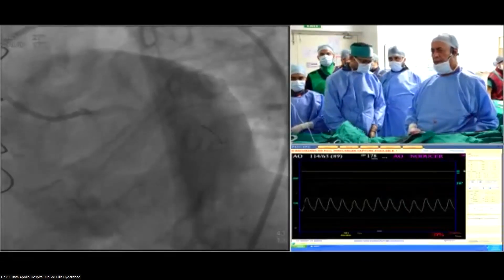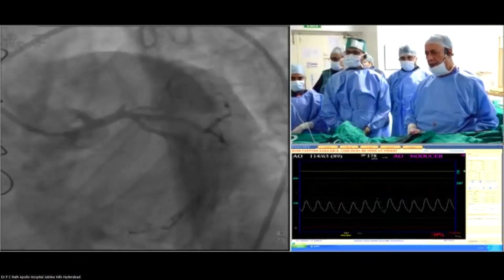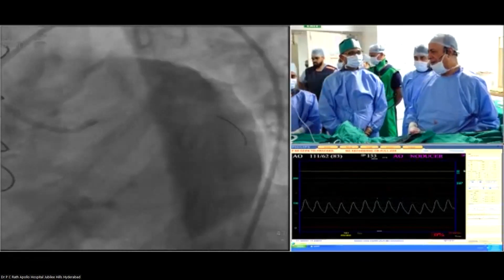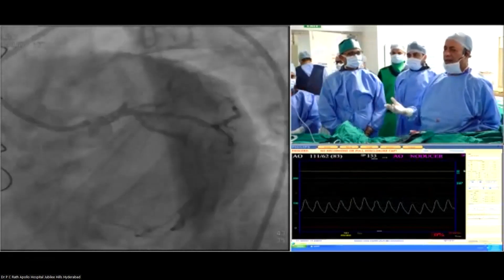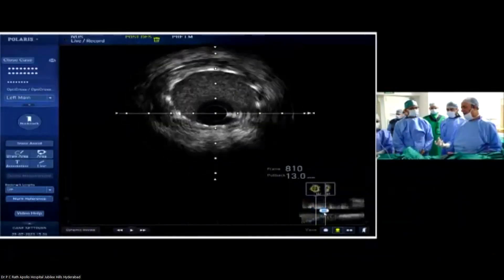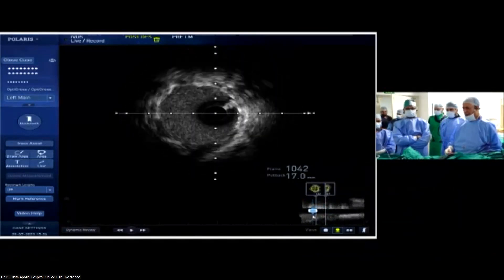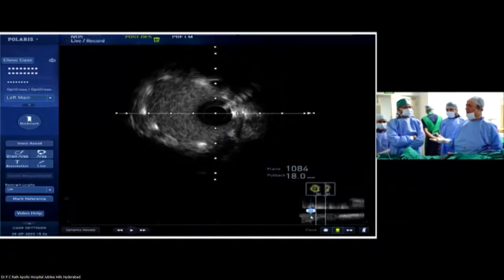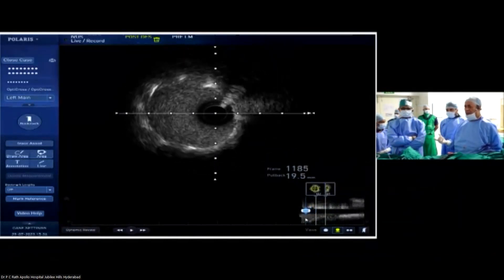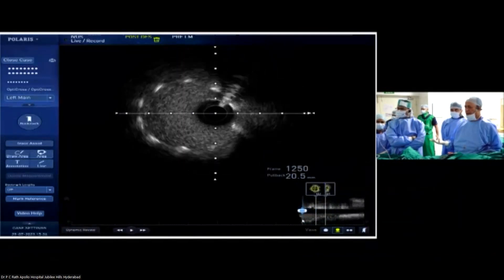My question is: the telescope-guided OCT versus IVUS — which is more beneficial? Obviously, if you look at the clarity, OCT is superior to intravascular ultrasound. The only thing is, at the ostium, you will not technically be able to see. But if you want a clear picture, then you can use a telescope catheter and do it.